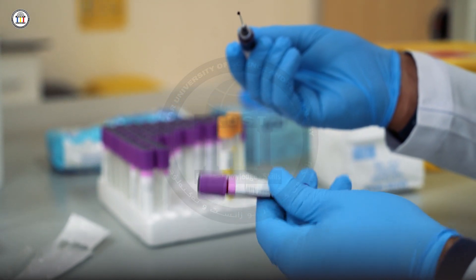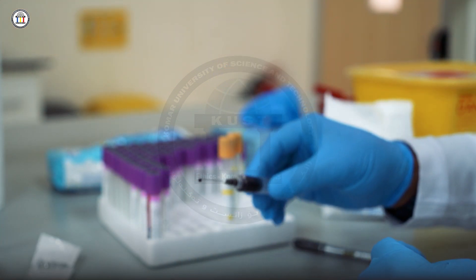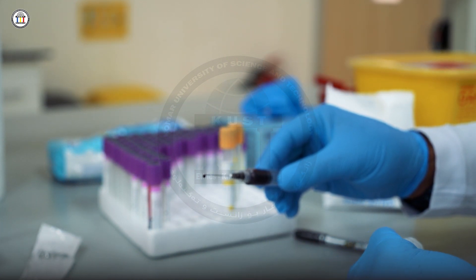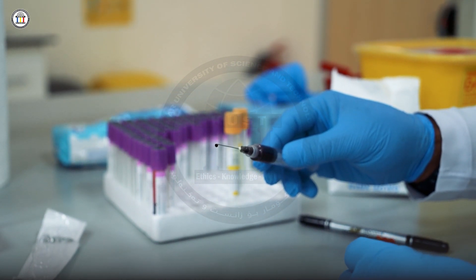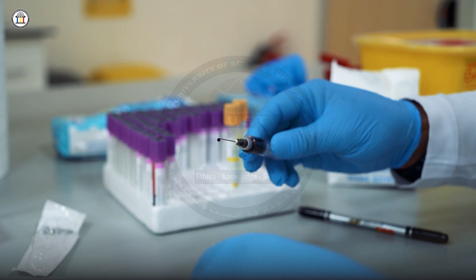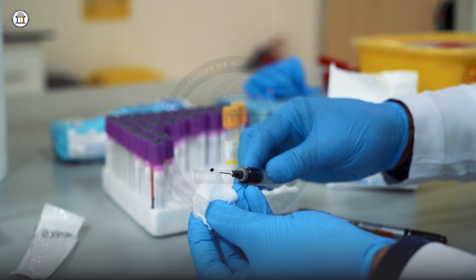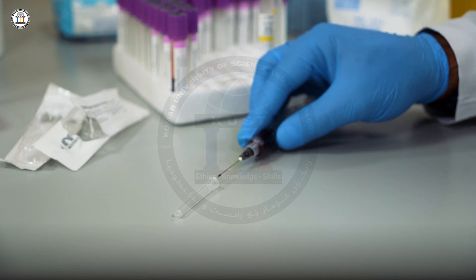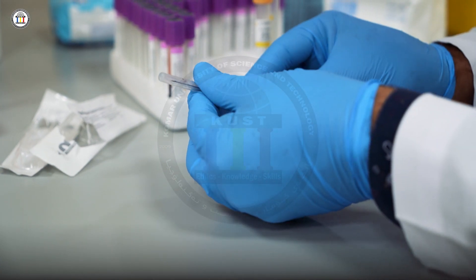Gently mix the sample and be careful about labeling. You can label before or after sampling — both are correct, but I prefer before sampling. Regarding recapping the needle, do not try to recap with two hands as you may face a needle stick injury. Instead, put the needle on a surface and use the one-hand technique to recap it, then screw the cap on.